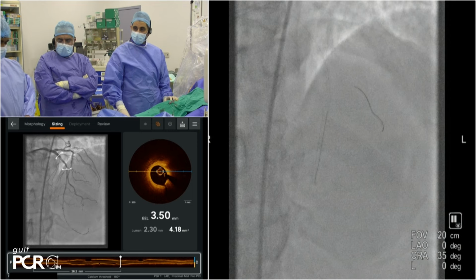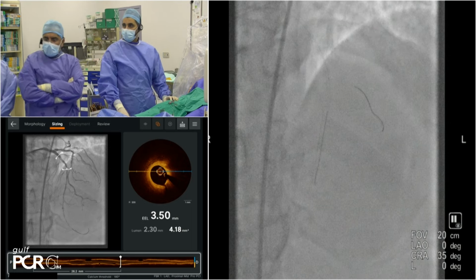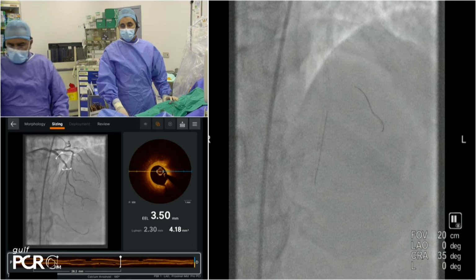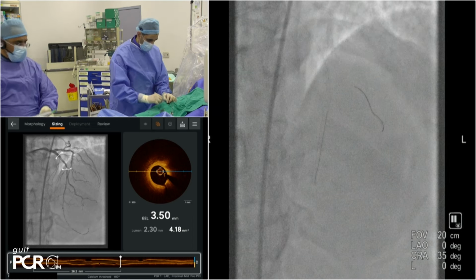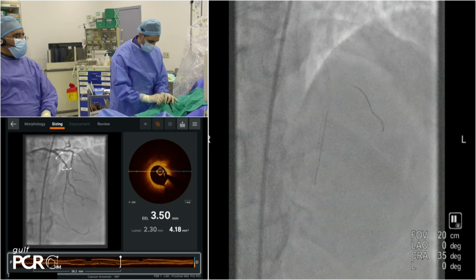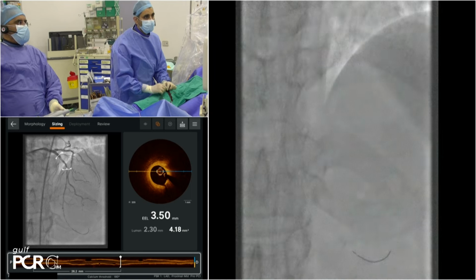Khaled, you can ask the technician to show us the image of the cath lab. Okay. You can carry on with your procedure. John, I didn't get that. Okay, we have the fluoroscopy now. Sure, let's go. Okay, let's see fluoro, please. Go to the big screen.